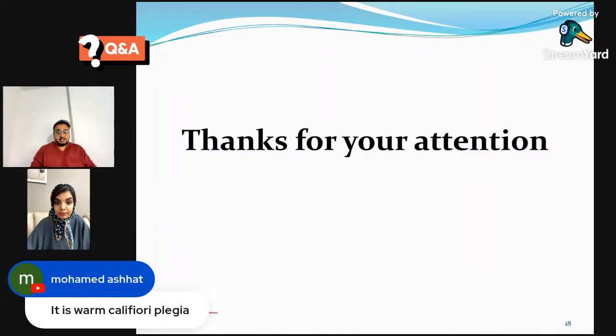I think we have one more question, about hot shot. Is it a warm cardioplegia? Can you say it again? Is it a warm cardioplegia? I think it is about hot shot, I guess. The temperature of the heart is 37.